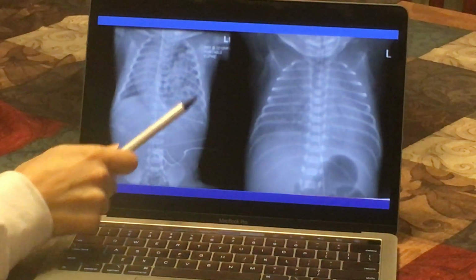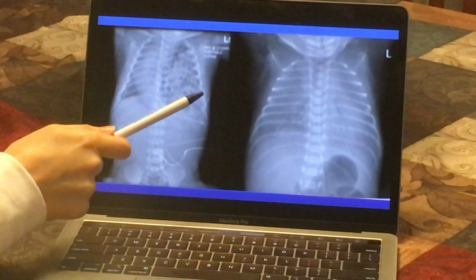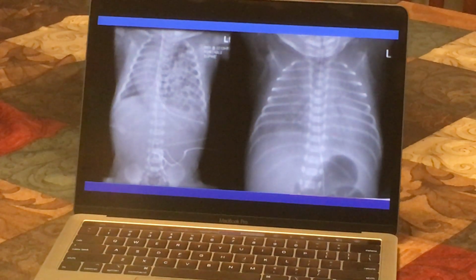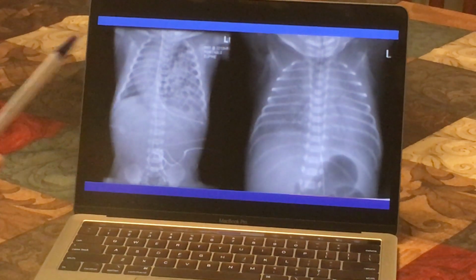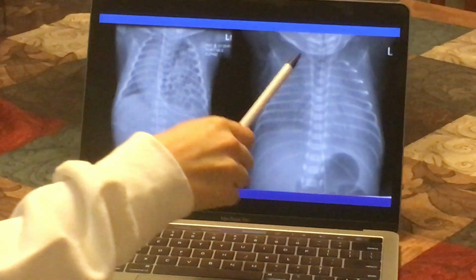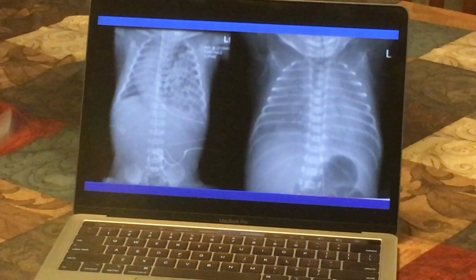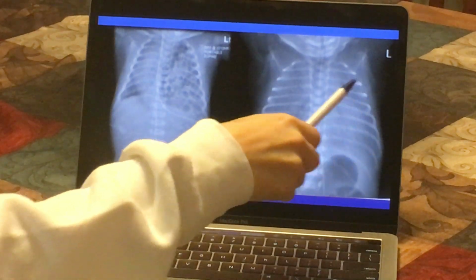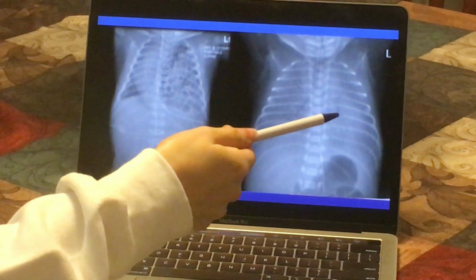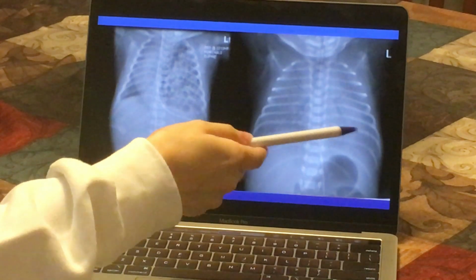First of all, you don't want to pop anything over here, especially before they're repaired. And you also don't want to give their one good lung something like a pneumothorax, because that's how a lot of these patients end up being cannulated for things like ECMO. And over here on your right, we just have your very basic IRDS film. Very low lung volumes, not good aeration, low compliance, hard to ventilate. This is a good candidate for the jet as well.